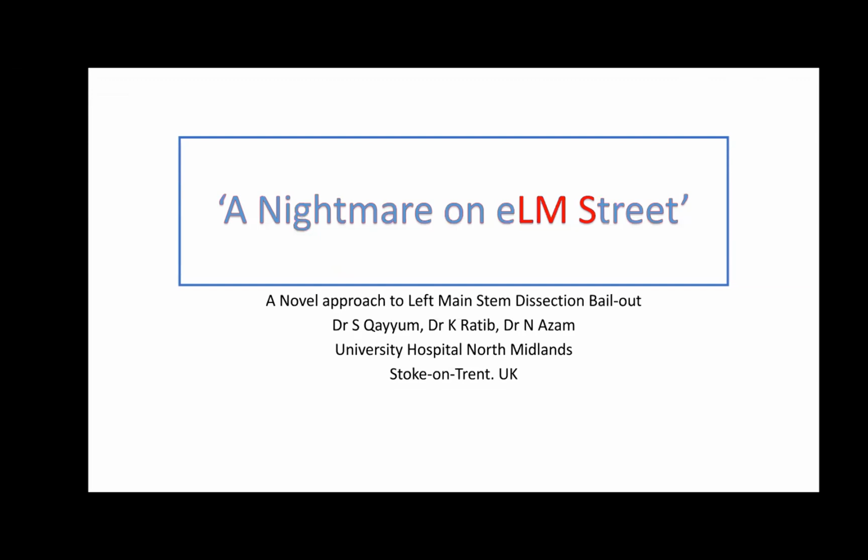Probably not. I think if you had a guide liner and used the OCT through the guide liner, then you could fill the image and clear the contrast. But with this left main, having that sort of post-stenotic dilatation, it would probably not have helped.